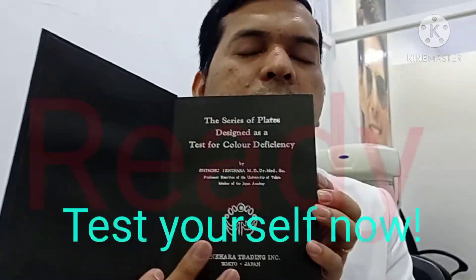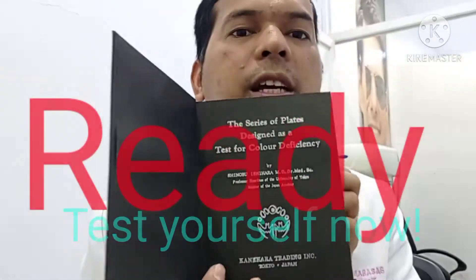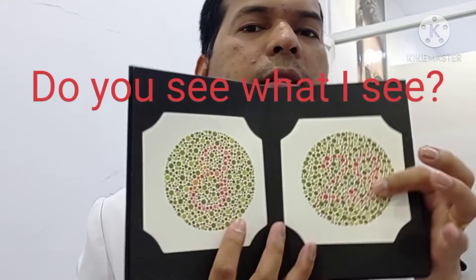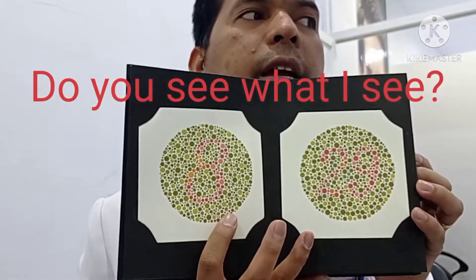So let's find it out. What number is this? This is a demonstration now. Number two. Okay, next. And then this one — number 12. And this one — three seconds — number eight, number 29.